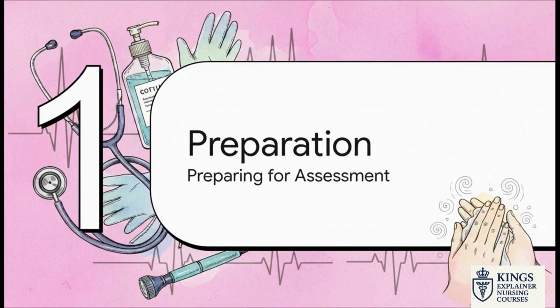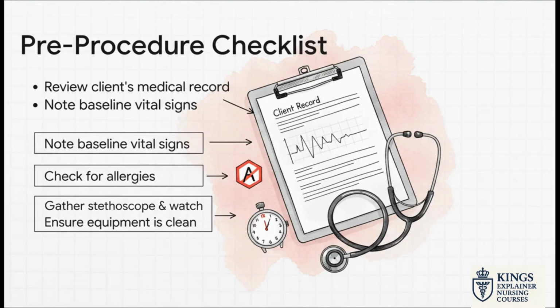Okay, let's get into it. We'll start with Section 1, preparation. A perfect assessment actually begins long before you even touch your stethoscope. Nailing this part is your first line of defense against any errors. So let's run through this pre-procedure checklist. Every single item here is a crucial safety step.